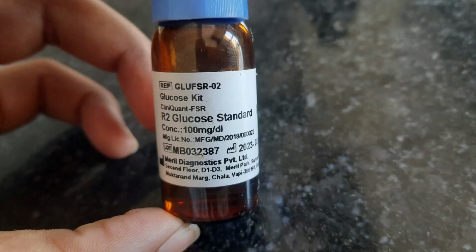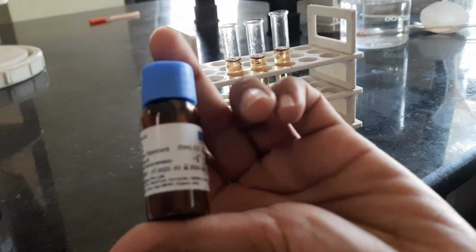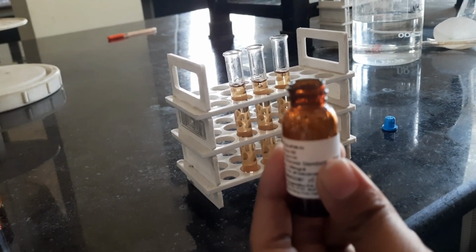Next thing that we will need is the glucose standard. This glucose standard comes in a ready-made form in the market, and also you can prepare it in-house. So we will be taking 50 microliters of this glucose standard and will put it into the test tube labeled as standard.